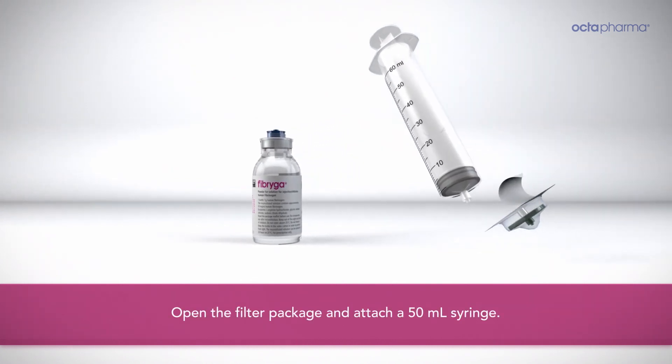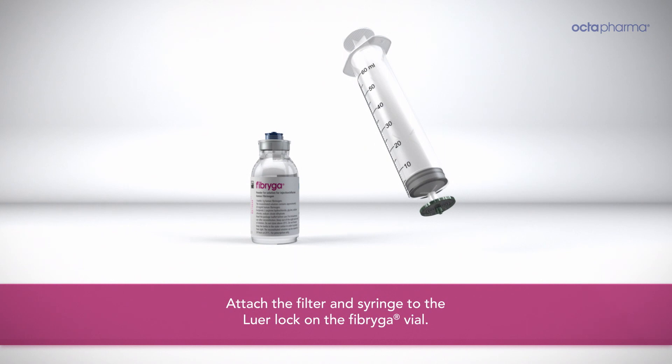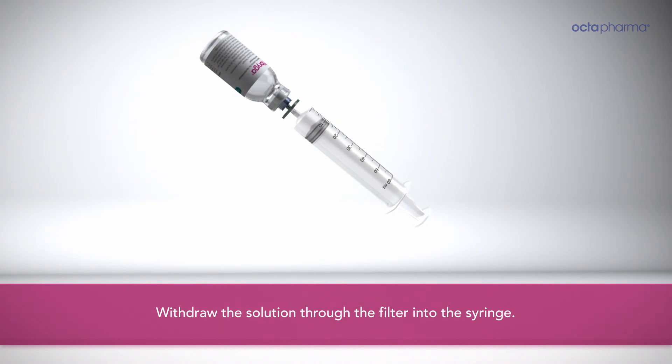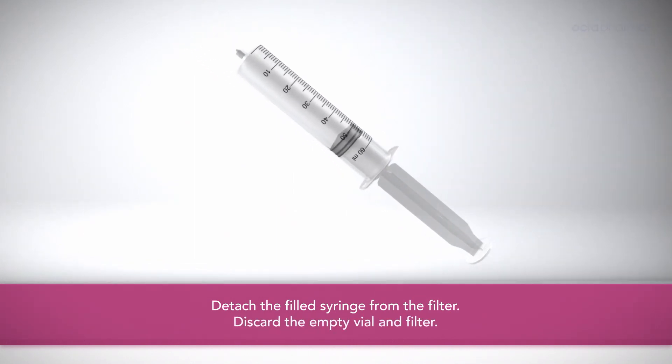Open the filter package and attach a 50 ml syringe. Attach the filter and syringe to the lure lock on the Fibriga vial. Withdraw the solution through the filter into the syringe. Detach the filled syringe from the filter and discard the empty vial.